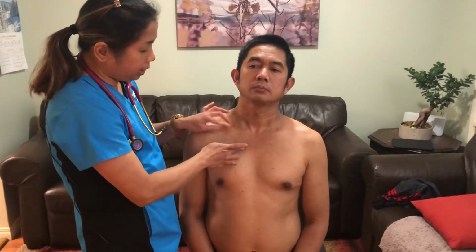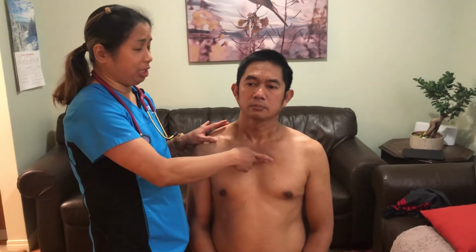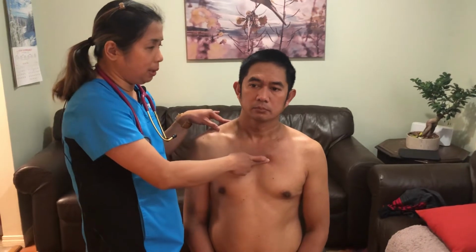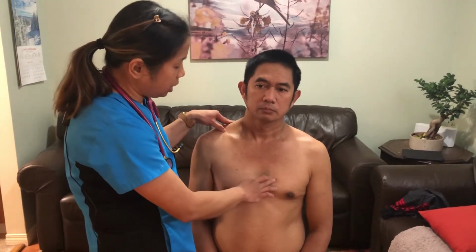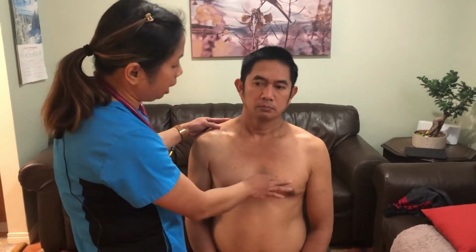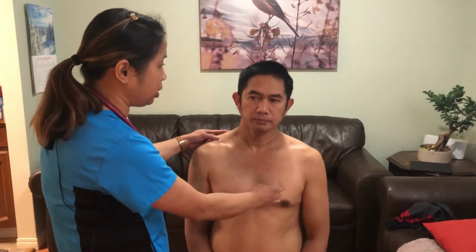Then going to the left second intercostal space, which is the pulmonic valve, then the fifth intercostal space at the left sternal border, which is the tricuspid valve, and then the mid-clavicular fifth intercostal space, which is your mitral valve.